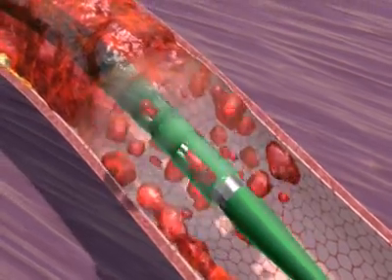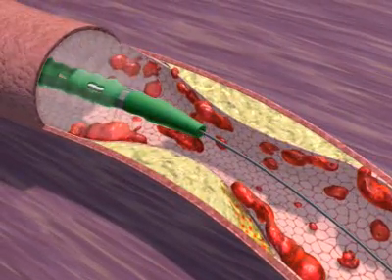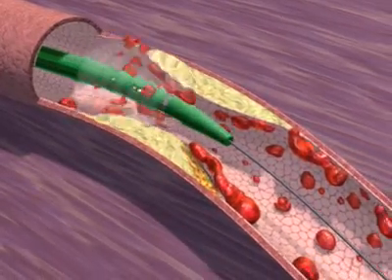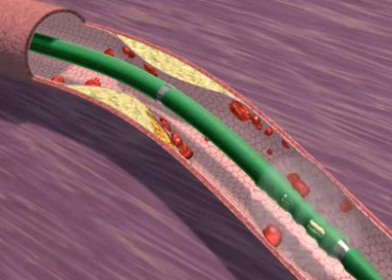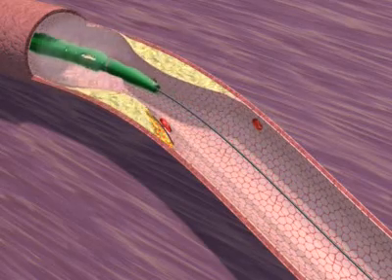The angiojet catheter is shown here removing the bulk of the thrombus. A second pass removes more thrombus. The angiojet catheter is passed several times until the operator is comfortable that all angiographically apparent thrombus has been removed.